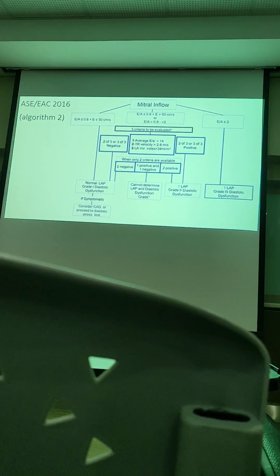So ni dah tangkap gambar dah, okay? Kalau perasankan kat tengah-tengah ni, there is also an indeterminate punya section juga.